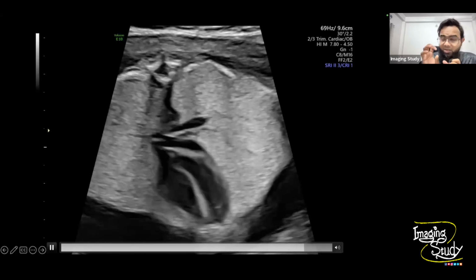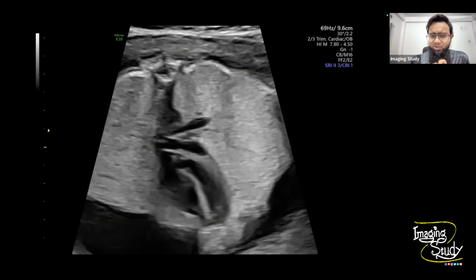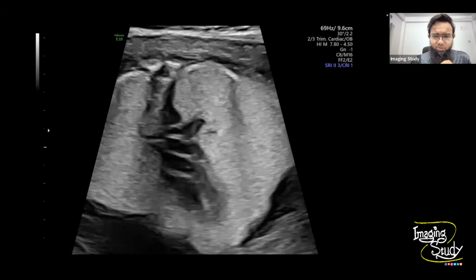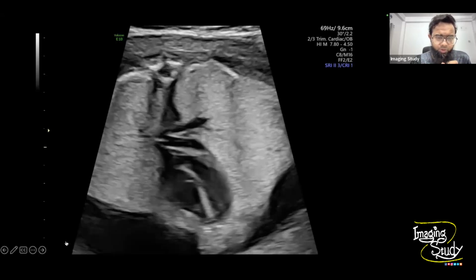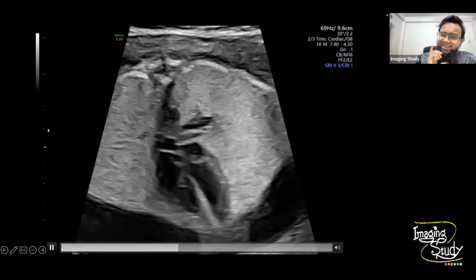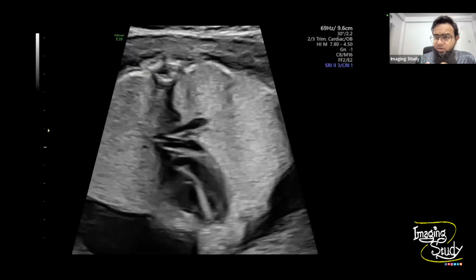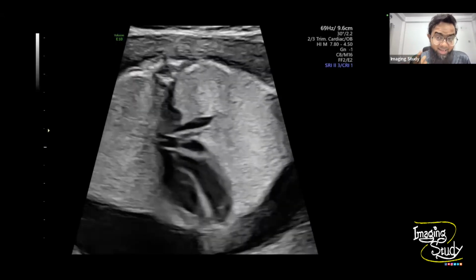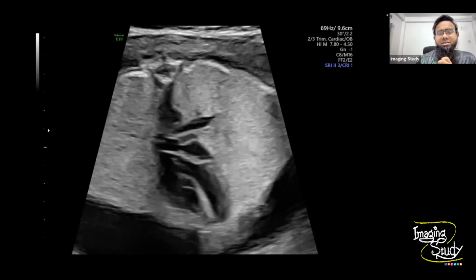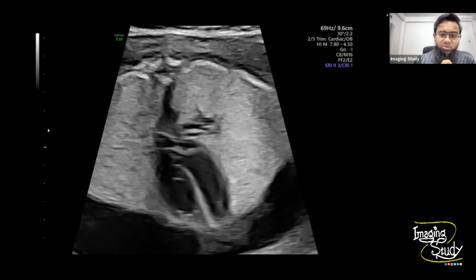When it was very slow, I was just trying to check the pulse wave Doppler to see the heart rate. But when I came back to real time, it just got resolved. So now it's pumping well. At the beginning, it was a little bit slower. Anyway, it indicates that the fetus is already getting some bradycardia or bradyarrhythmia or cardiac arrhythmia because you are compressing the heart. So the situation is getting worse. No, we are not very satisfied with the situation.